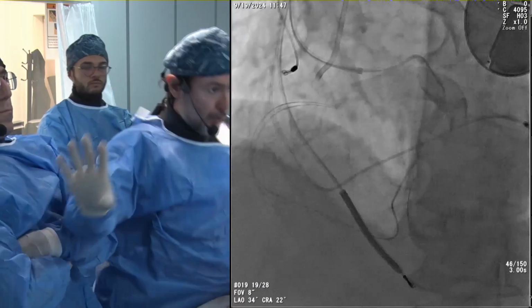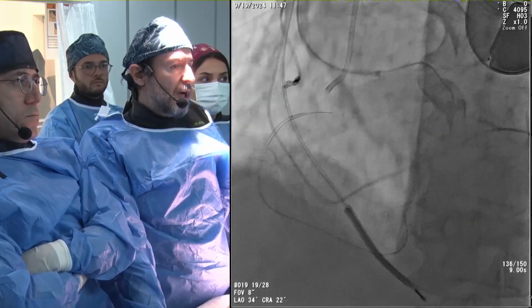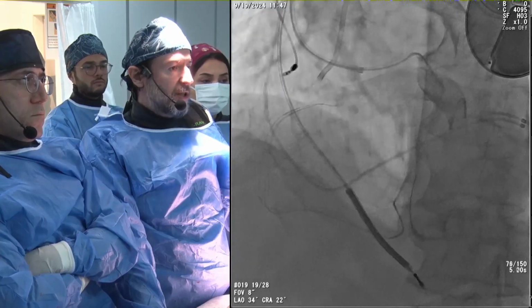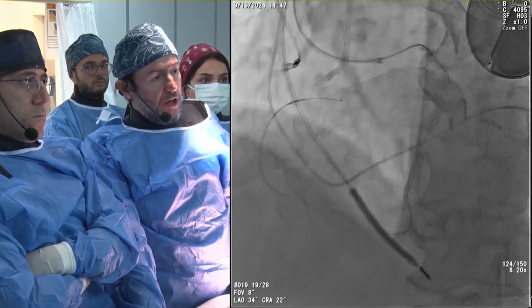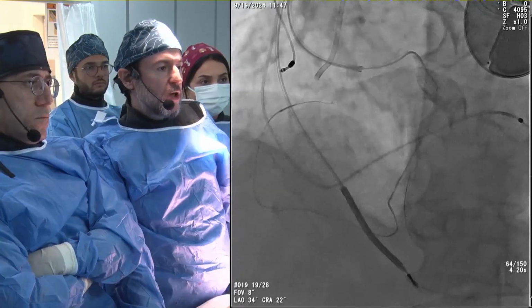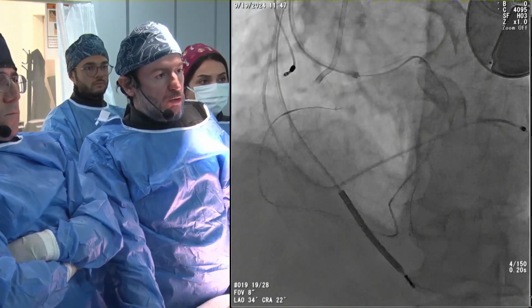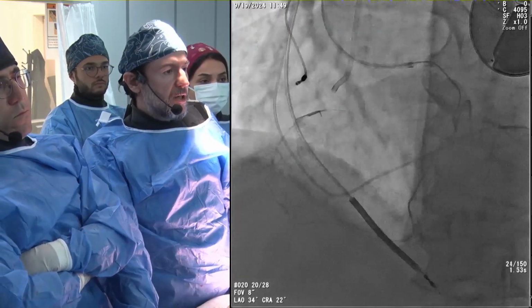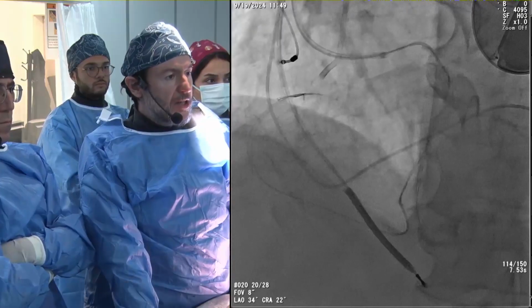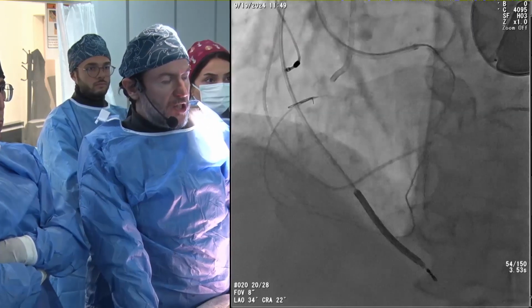So with the knuckle, we reached as far as we could, and here comes our microcatheter going into the CTO lesion itself. And this calcification there, we opted to treat as an ostium, so it was a marker for us. We were not sure, of course. Next one, please. And this is the 3 gram Pilot, and we went downwards, but actually we didn't like this, and we were discussing whether we should do Carlino or not.